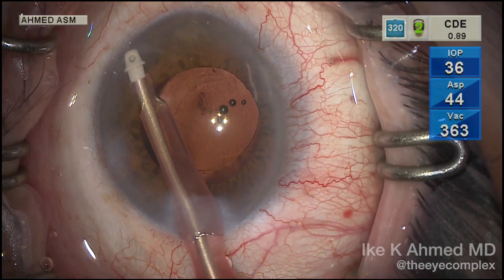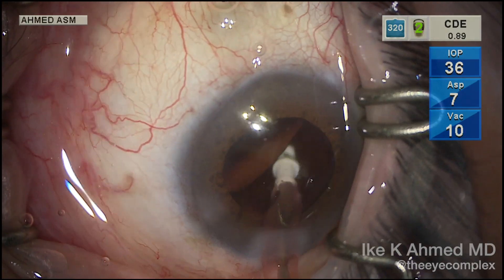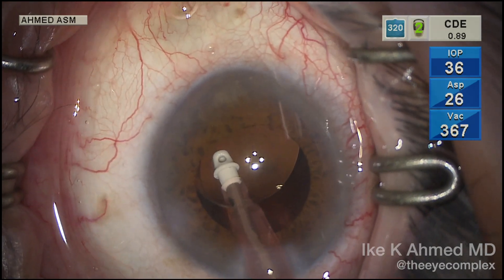The IA is done. It's important to remove all the viscoelastic from the anterior chamber, including behind the lens, to prevent early pressure spikes, and this is of course facilitated by removal of all the viscoelastic in the eye.